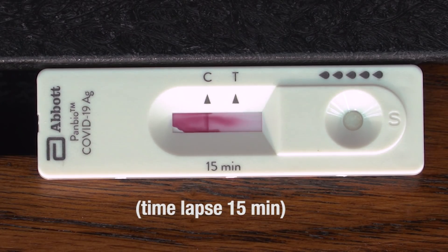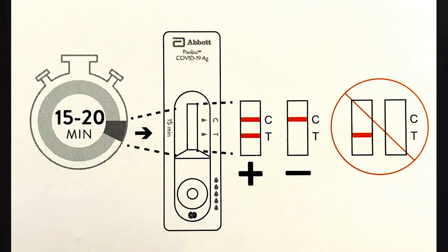Now we have my result — I'm negative. One red line under the C is a negative result. A red line under the C and under the T is a positive result. One red line under the T only is an inconclusive result. Both the nasal swab and the NP swab work in the same manner. Anyone with a positive result or an inconclusive result is legally required to isolate and must leave the worksite immediately. These individuals should seek a confirmatory test at an AHS assessment centre. If they test negative at an AHS assessment centre, they are allowed to return to the workplace. If they test positive, they must isolate for 10 days.